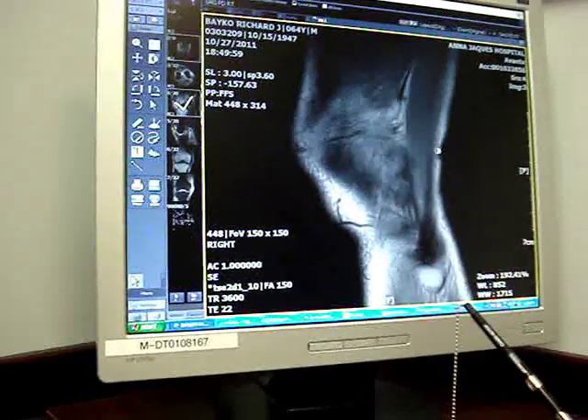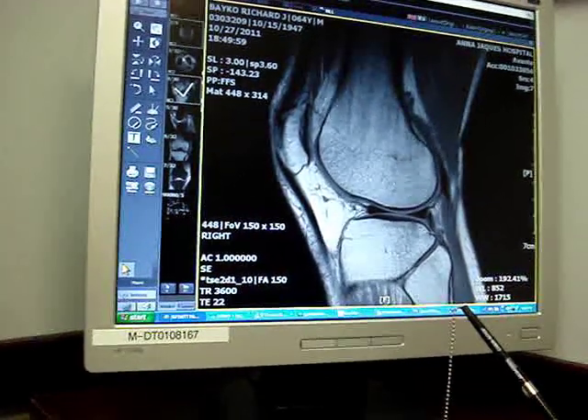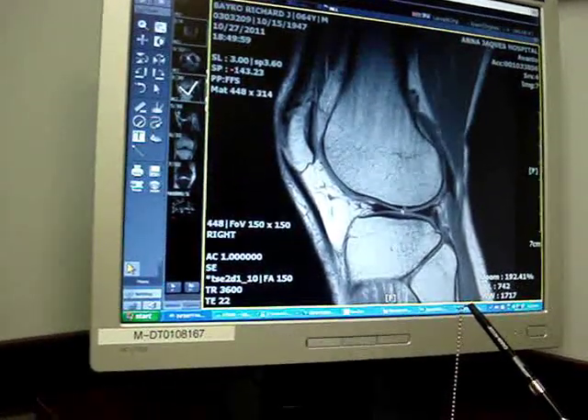Usually there's not a problem. So we're looking at the knee from the side — we're starting on the outside of your knee, going to the inside. There's the front with your kneecap, there's the back. The meniscus on the outside, these sharp triangles right there — it's a normal meniscus, that's how it should look.